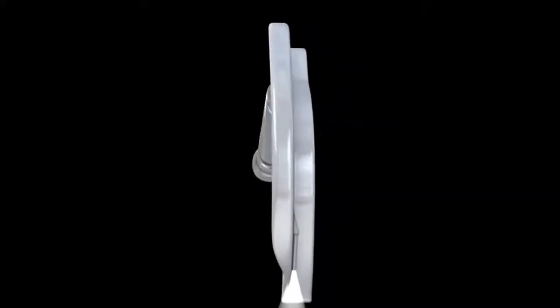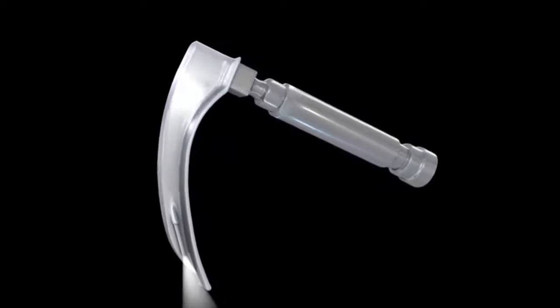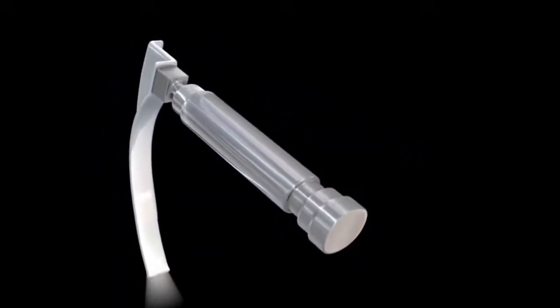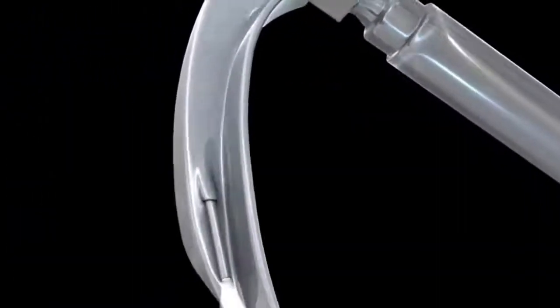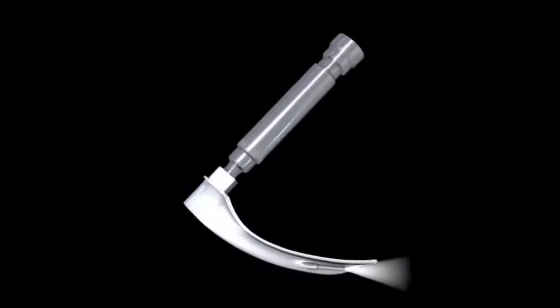The first step in mechanical ventilation is called endotracheal intubation. Once you are asleep, your doctor will use an instrument called a laryngoscope to perform the intubation. A laryngoscope, which consists of a handle, lights, and dull blade, helps guide the endotracheal tube to its proper position.